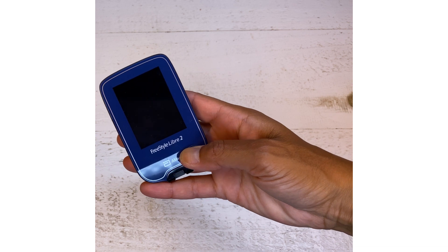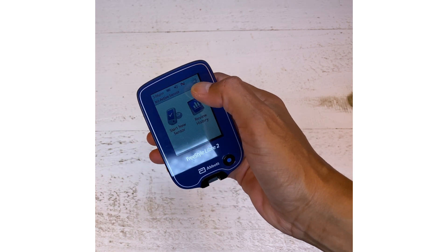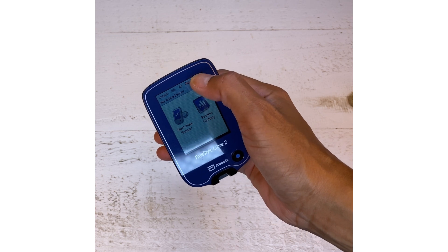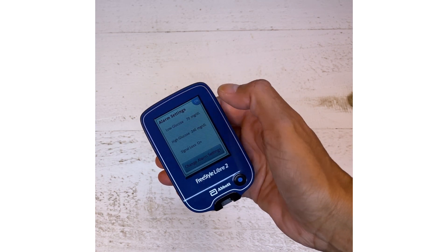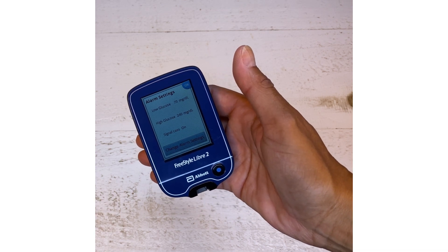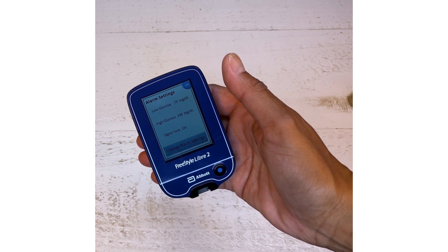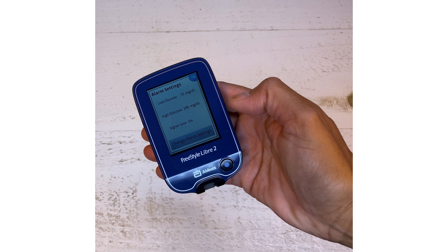Now let's look at the alarms. This is a touchscreen — open up the menu in the upper right corner and click Alarms. Here you can see the factory settings: low glucose is 70 mg/dL, high glucose is 240, and signal loss is on. You can change those by clicking on Change Alarm Settings.